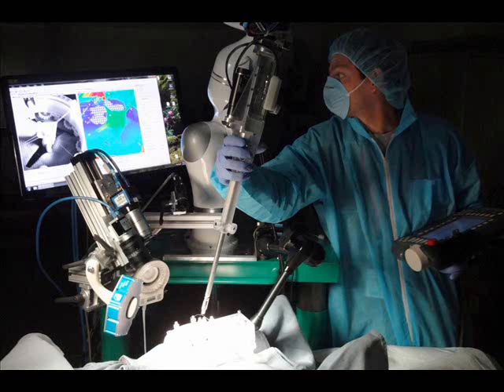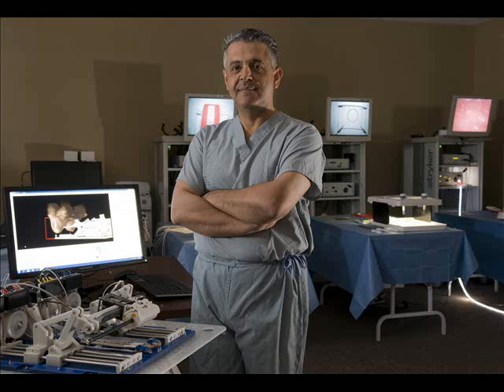In 2002, surgeons at the Cleveland Clinic in Florida reported and published their preliminary experience with minimally invasive hybrid procedures. These procedures combined robotic revascularization and coronary stenting and further expanded the role of robots in coronary bypass to patients with disease in multiple vessels. Ongoing research on the outcomes of robotic-assisted CABG and hybrid CABG is being done.